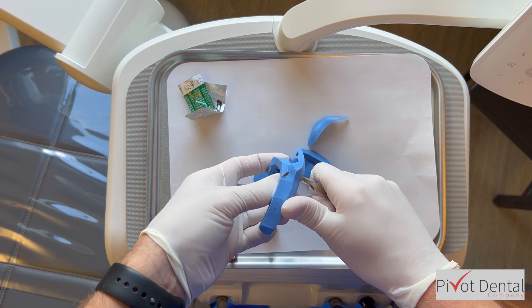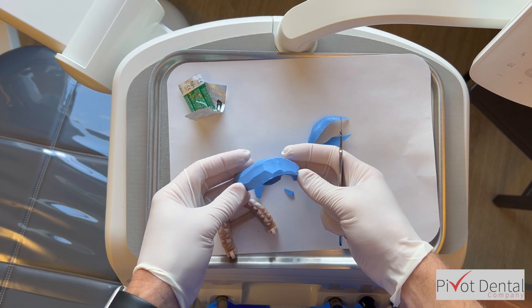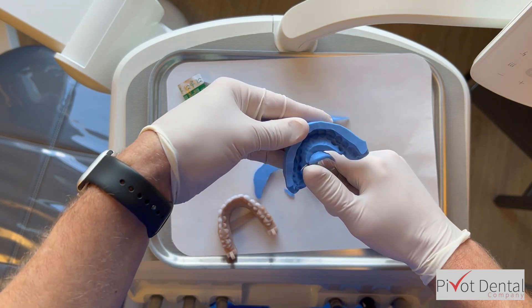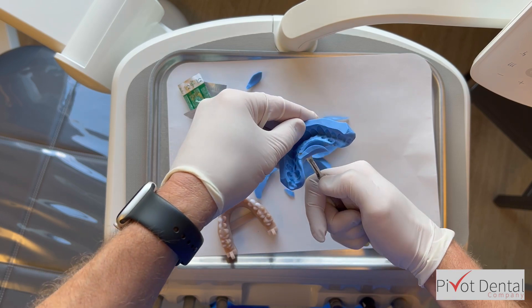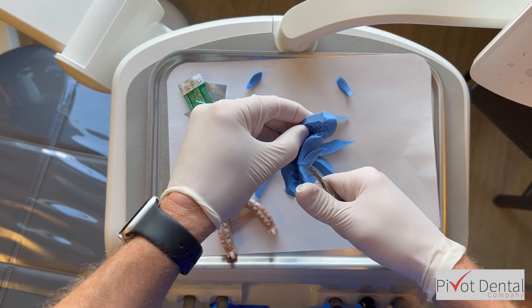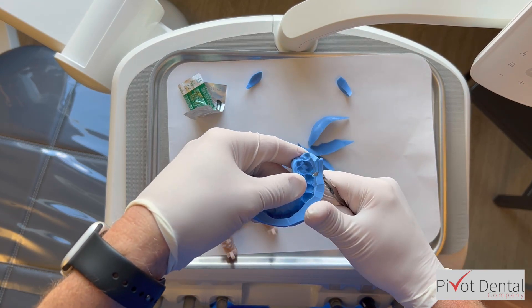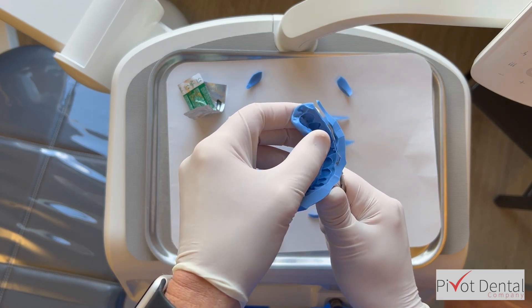As I'm trimming, I'm thinking about how this material needs to be thin enough to be comfortable for the patient while the temporary material sets, but thick enough that it's not flimsy. There's a little bit of an art to this — when pressing it into place and trimming, it needs to be sturdy enough to hold its position to make the temporary, but also thin enough that you can actually insert it.